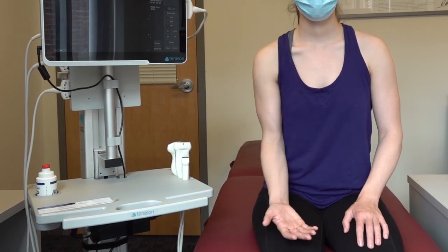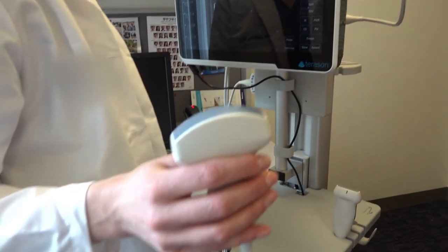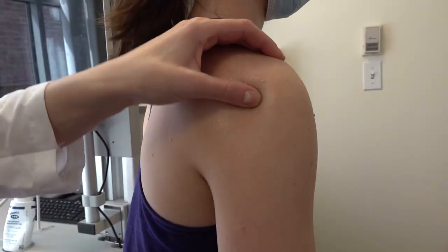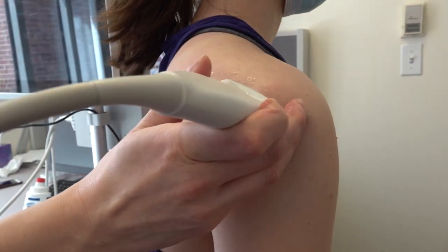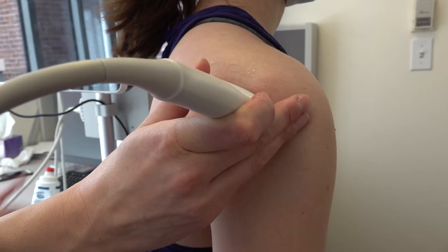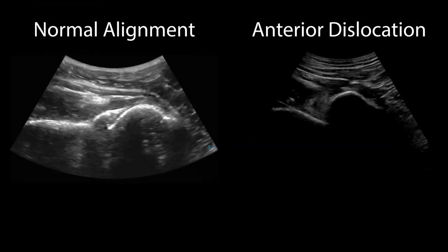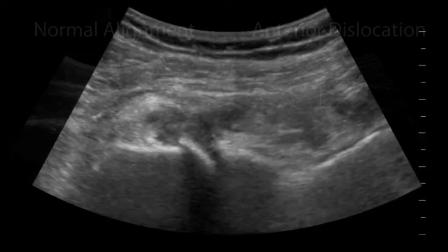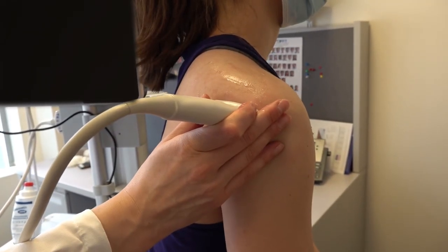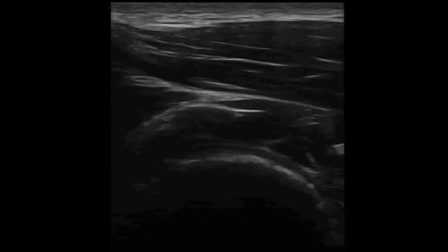Have the patient rest the symptomatic forearm in a position of comfort. For this examination, the curvilinear probe may be preferable depending on body habitus. Place the probe, oriented transversely, below the scapular spine at the level of the posterior glenohumeral joint. Examine the posterior humeral head and scapula to evaluate for horizontal alignment of the joint and for potential effusion. In this view of the glenohumeral joint, the infraspinatus tendon can be evaluated longitudinally and transversely.